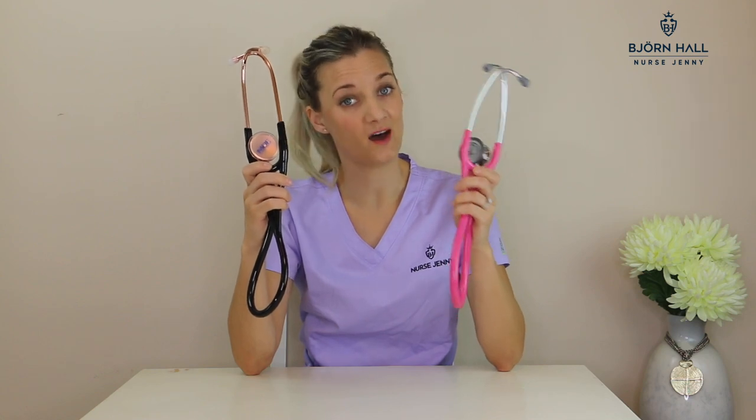Spare kit: with the MDF you will receive a set of small eartips, a set of large eartips, a spare diaphragm, and a name tag. With the Littmann you'll receive a set of soft eartips, a set of hard eartips, a non-chill rim, and a user manual.